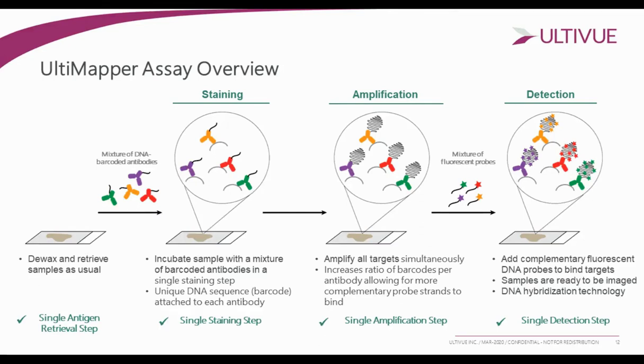This linear amplification allows us to see a wide variety of expression of certain functional markers such as PD-L1. It allows us to differentiate low to medium to high expressors. In comparison, when you're using something like an HRP conjugate, that type of amplification is generally much more geometric, meaning it tends to hit saturation quite quickly. And that means your medium to high expressors hit saturation quite easily, and it's harder to decipher or separate the range of expression between those types of cells.